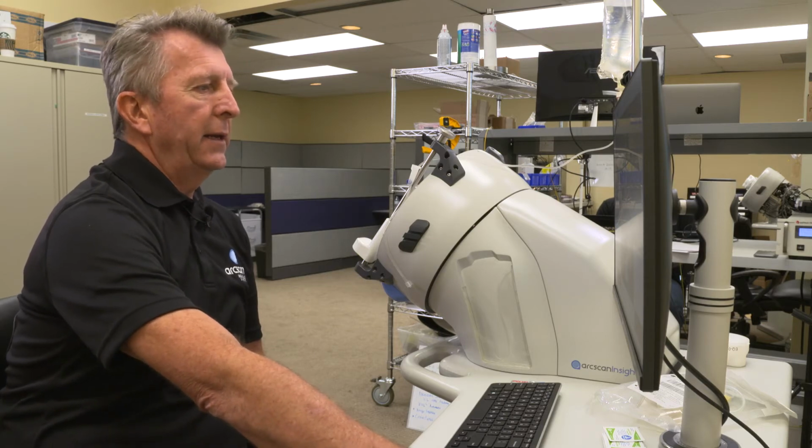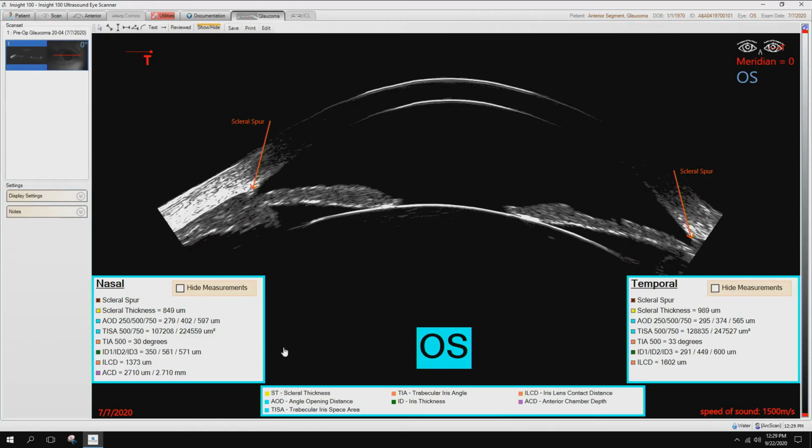Here we've gone ahead and recalculated this. So down here you have options on both sides. If you want to go ahead and show, here's the scleral thickness, you can see clearly that that is the area that it's measuring. All of these measurements are the standard Pavlin measurements for glaucoma. So I can click or unclick each of the various measurements that are taken.